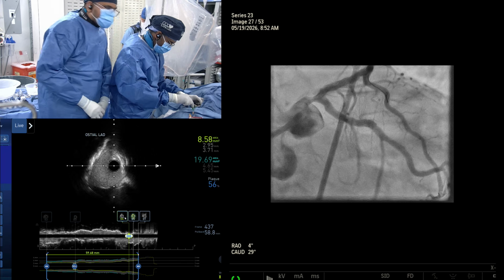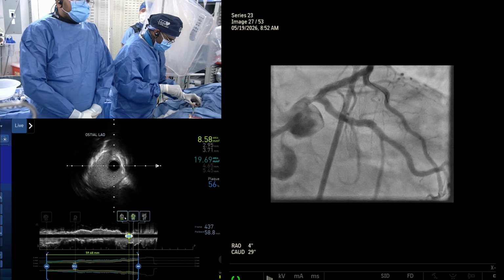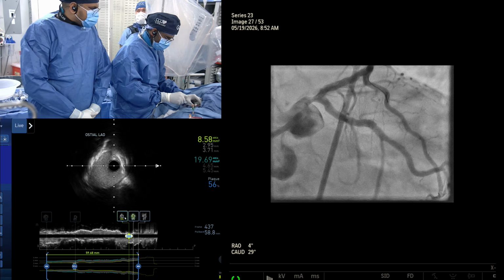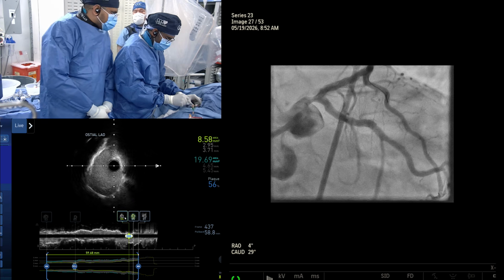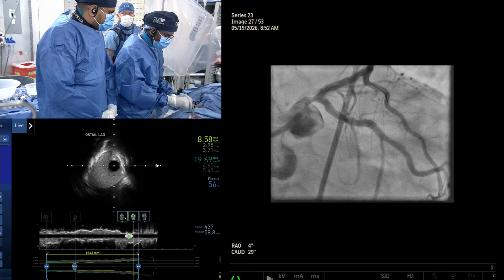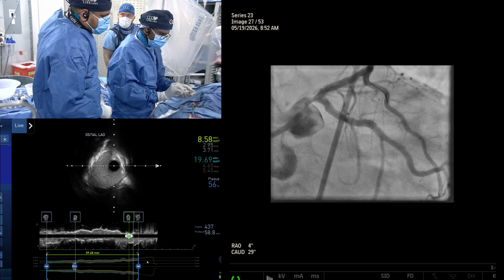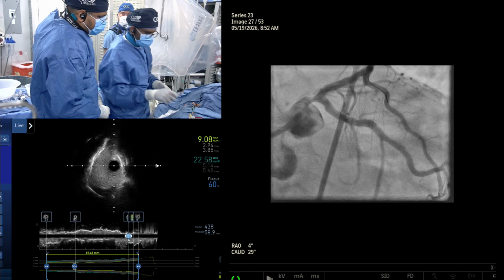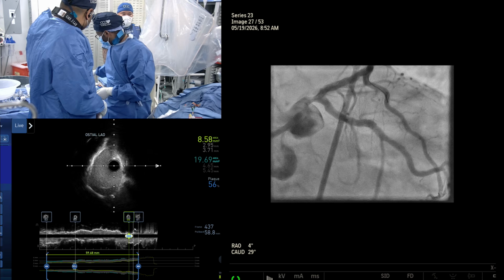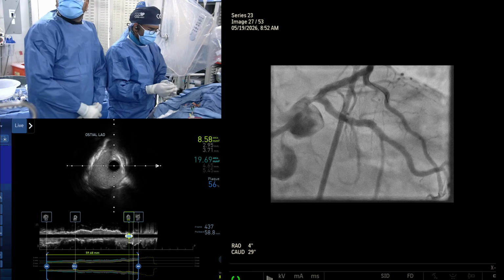But most of the time, micro OCT or pathology studies have shown that once you've done IVL, you always see some kind of microfracture in this calcium. But it looks like despite us doing 4 pulses in the ostium, Kiski, show it to them, the stent expansion is not optimal.